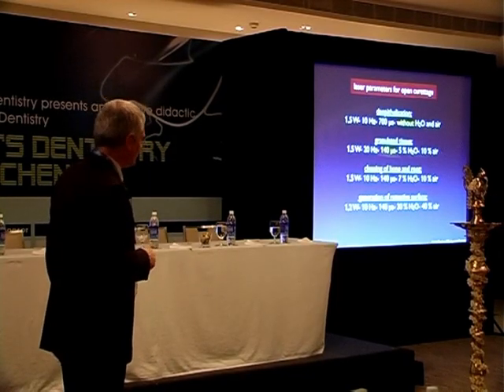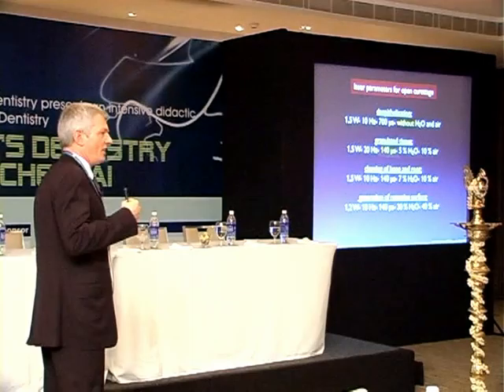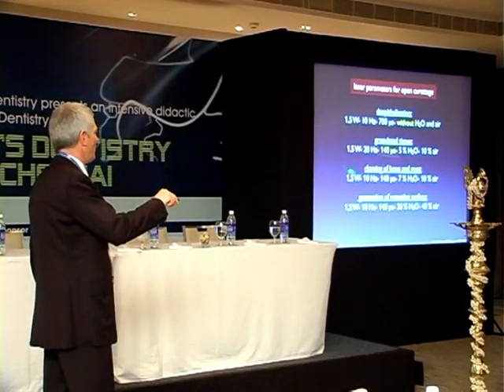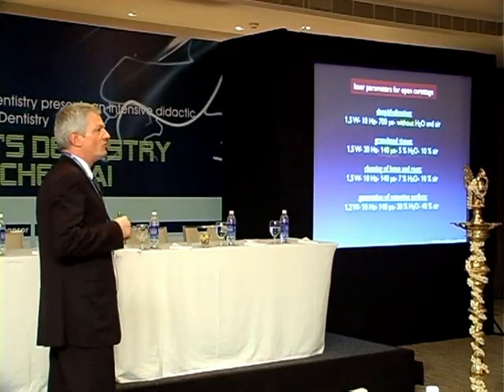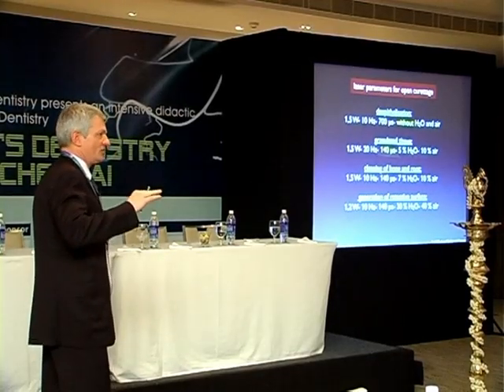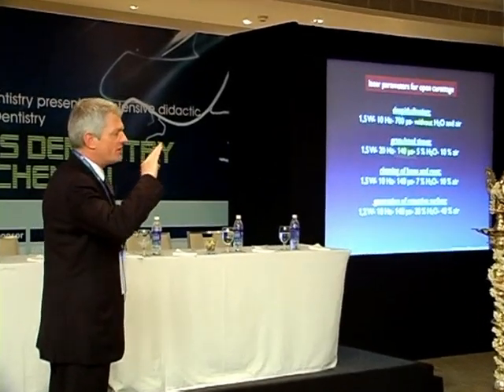Cleaning of bone and root with a short pulse, because it's hard tissue, and with a minimum amount of energy, because you do not want to ablate the bone, you just want to clean the bone. So you just put very, very little of the surface away, just very slightly. And you can generate a retentive surface on the bone, then you get a better regrowth of the gingiva, with 1.2 watt.